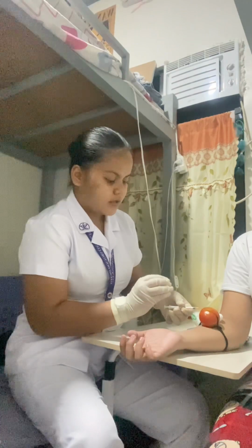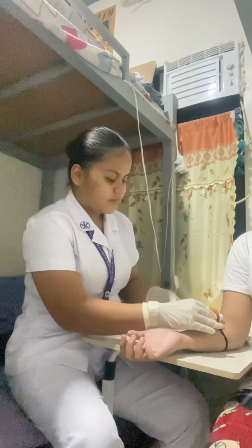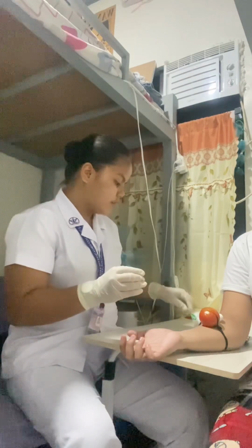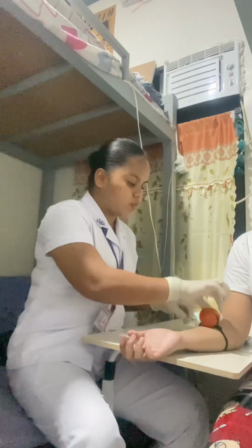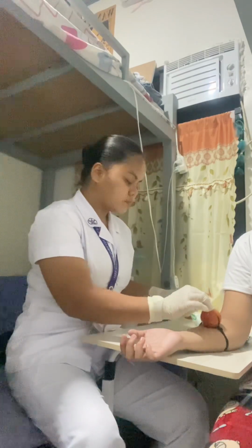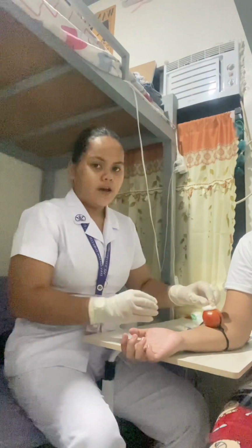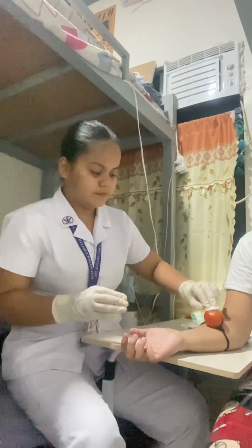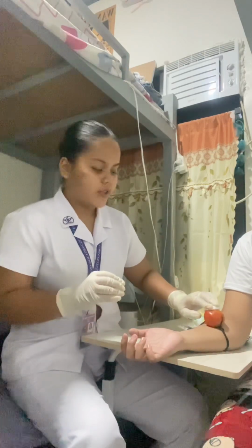After that, I am going to withdraw the injection and cover the needle. I have here prepared the swab. So if blood occurs, slowly or gently applying pressure onto it will help to stop the bleeding.